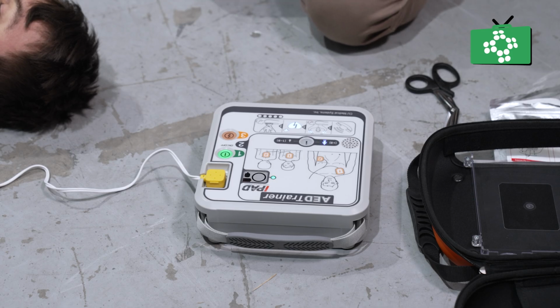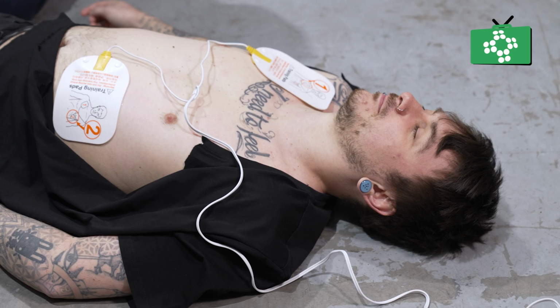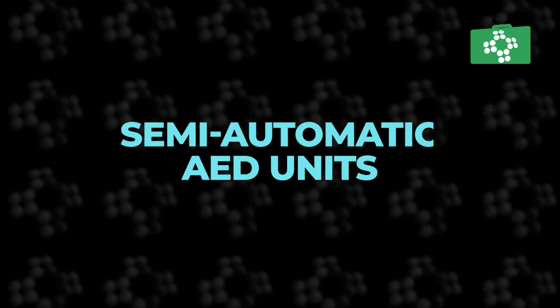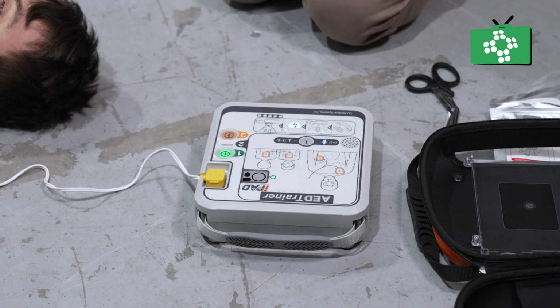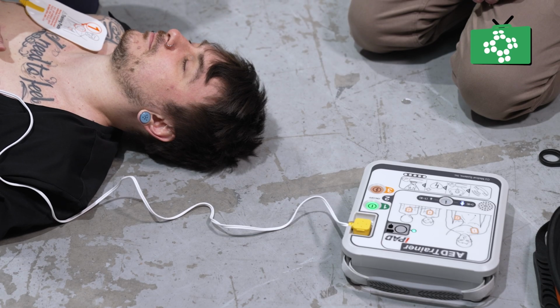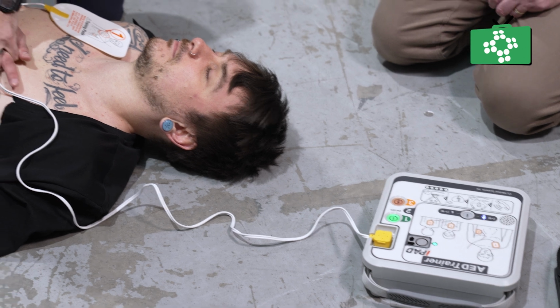If a shock is needed, it will tell you to stand clear of the patient and that a shock is advised, or in the case of a fully automatic AED, that it's about to deliver the shock. A fully automatic AED does not require you to push a shock button, but if you have a semi-automatic AED, you will need to push the shock button. We'll now describe the semi-automatic version. Look around to ensure everyone is clear before pressing the shock button. Press the shock button when prompted. If the unit says no shock advised, continue CPR and follow the voice prompts.